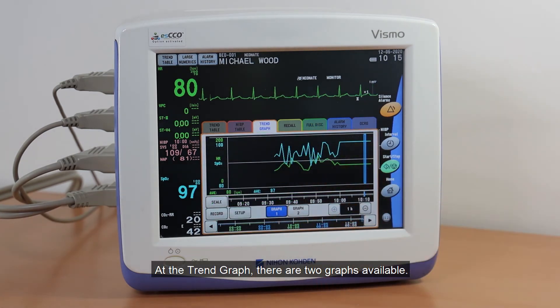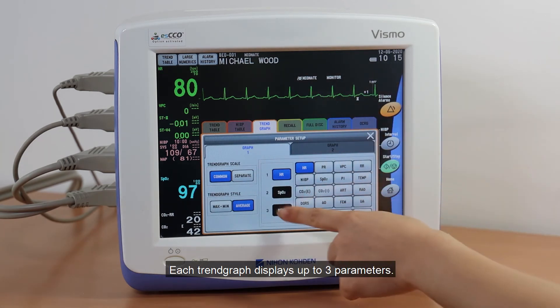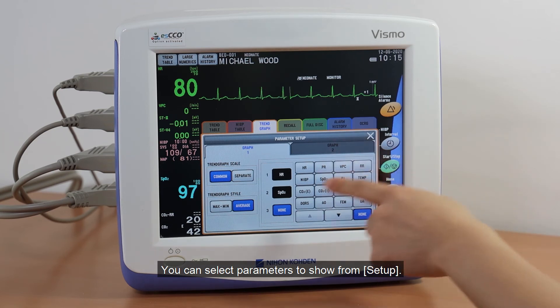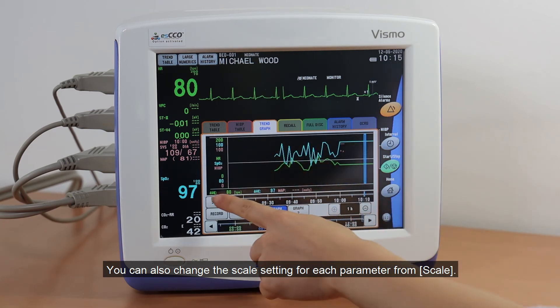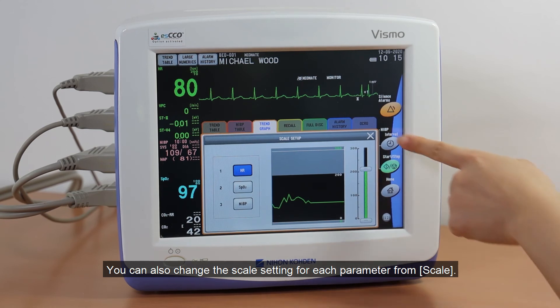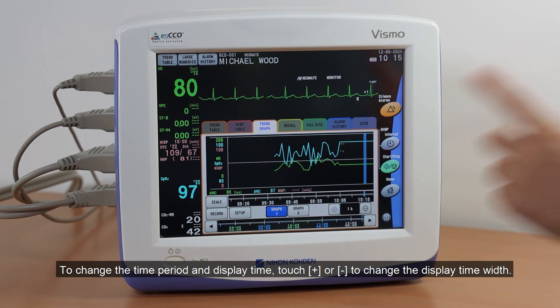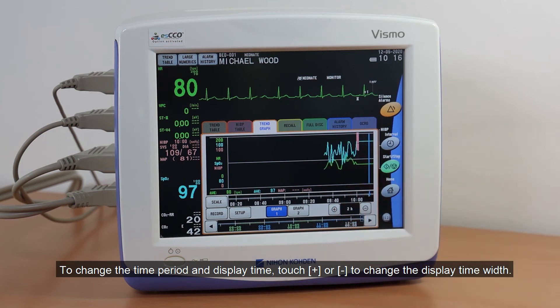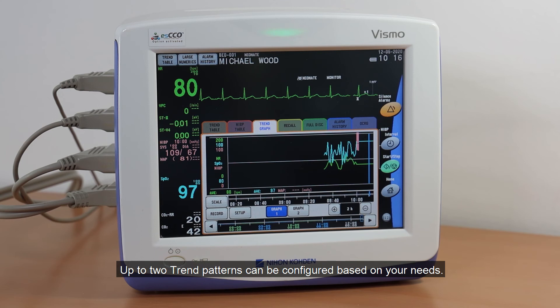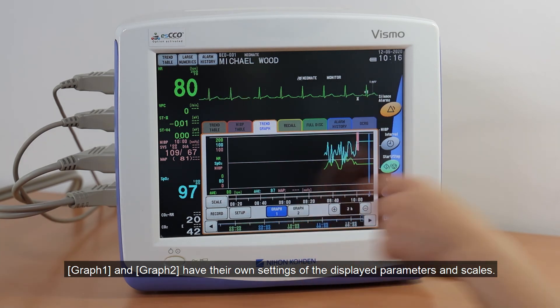At the Trend Graph, there are two graphs available. Each Trend Graph displays up to three parameters. You can select parameters to show from Setup. You can also change the Scale setting for each parameter from Scale. To change the time period and display time, touch Plus or Minus to change the display time width. Up to two Trend Patterns can be configured based on your needs. Graph 1 and Graph 2 have their own settings of the displayed parameters and scales.